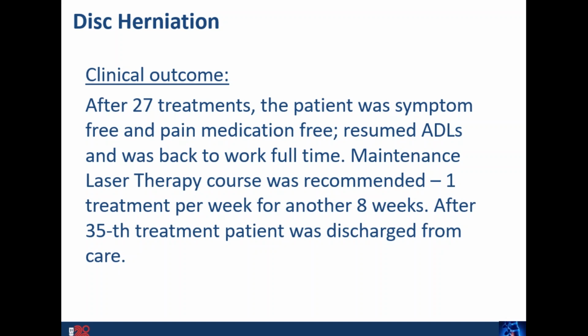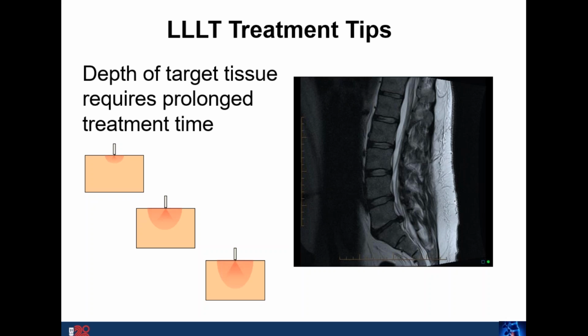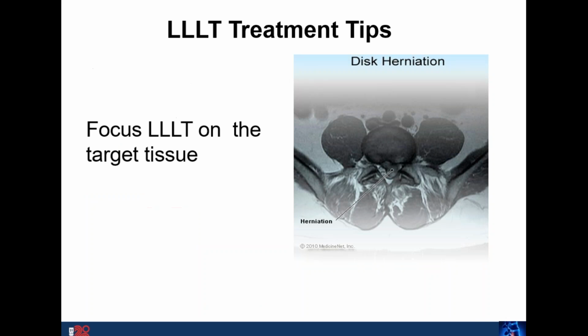So that would be a typical what to expect for that kind of scenario. Some treatment tips: remember the depth of the target tissue is quite deep in the lumbar region, so you want to make sure you hold the infrared probe for long enough. You might want to start with 10 seconds or so and work your way up to 15 or so seconds in one spot if you require that.